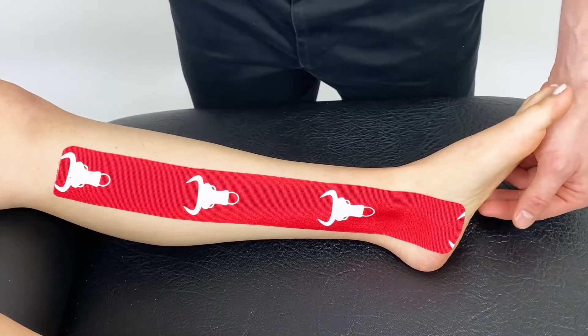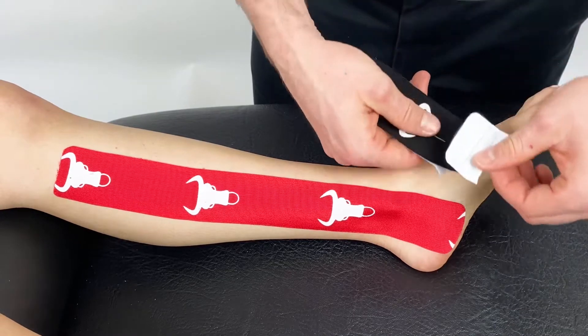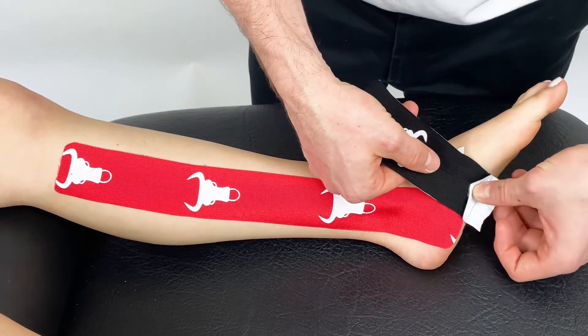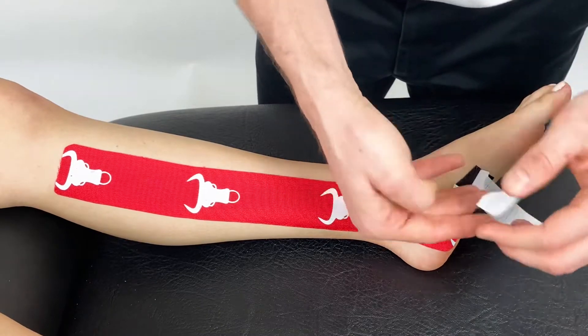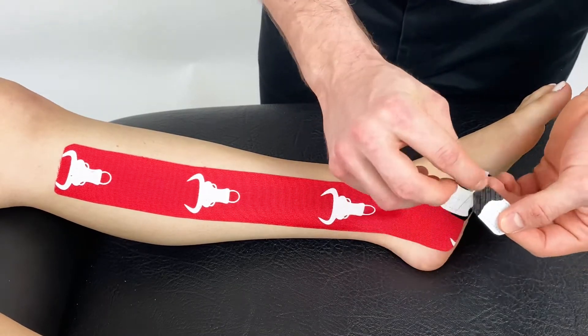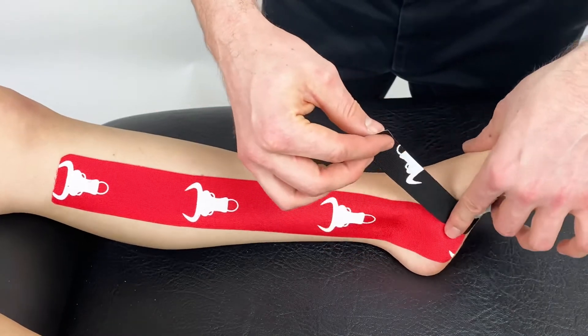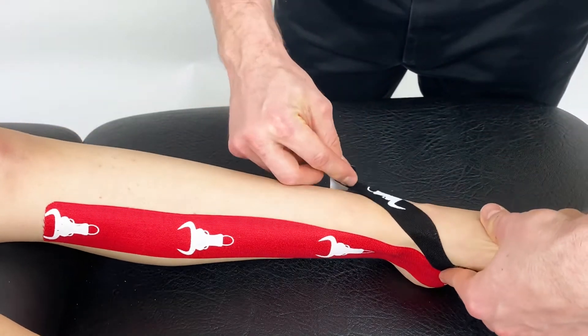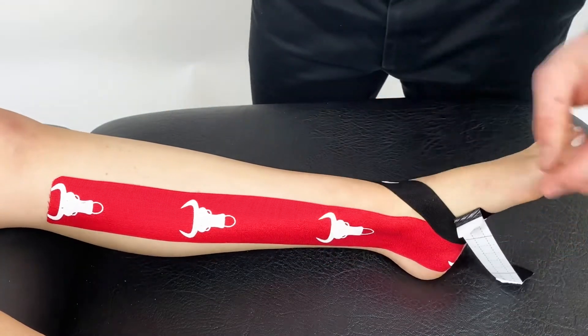From there we can get a smaller piece which will be a Y piece and anchor just next to the first piece like so. Remove one strand out of the way, remove the backing tape and apply over the ankle with moderate tension, ensuring that the anchor is placed down but with no tension.